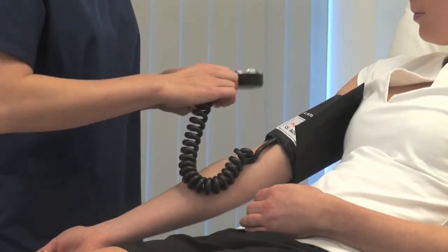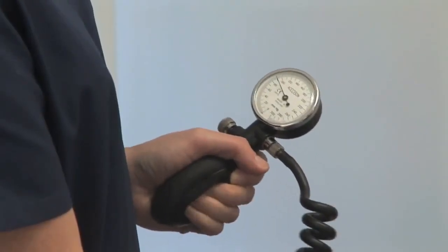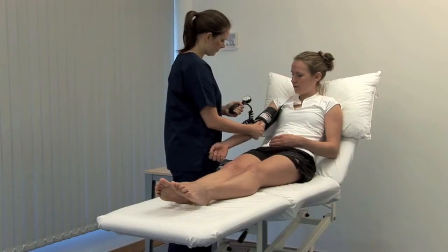Palpate the brachial pulse and inflate the cuff until the pulse becomes impalpable. Note this pressure as a rough estimate of the systolic blood pressure.